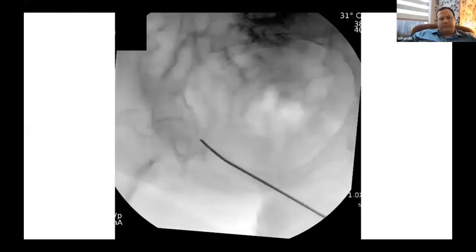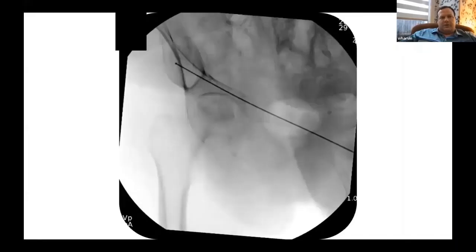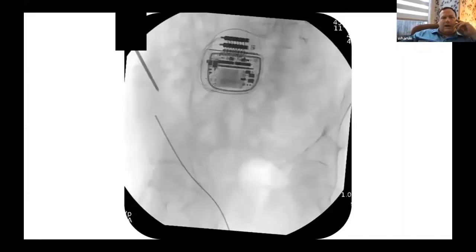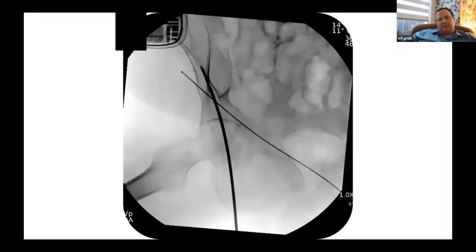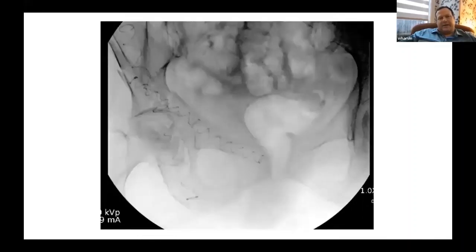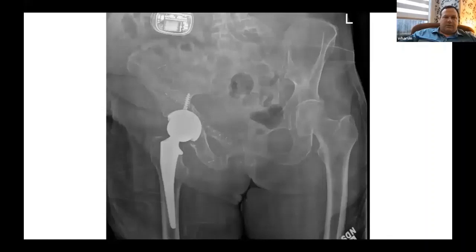We placed a retrograde anterior column balloon in traditional fashion for retrograde anterior column screws. I left the wire in so I wouldn't accidentally drill into and pop the balloon. I attempted an antegrade posterior column technique down the gluteal pillar, but technically it didn't work for me, so I went to my traditional retrograde posterior column — basically a retrograde butt screw going up the posterior column. We reamed up to get a bigger size and placed anterior and posterior column balloons, creating a stable construct for the acetabulum. My arthroplasty partner then performed a primary total hip — it was not unstable at all. This patient is about two months out and doing well.